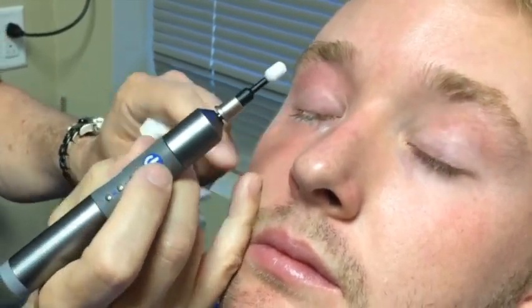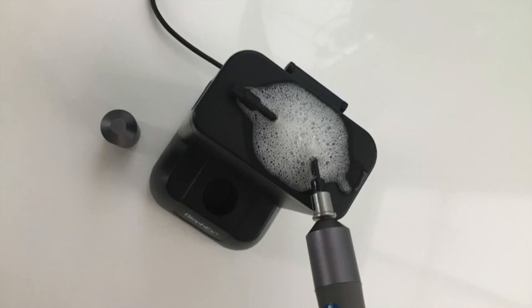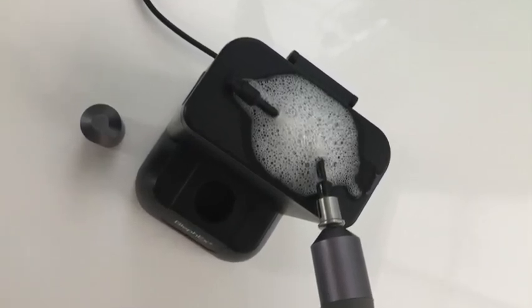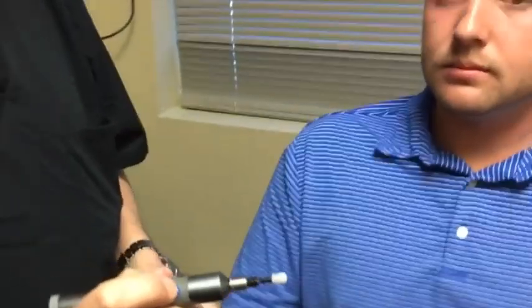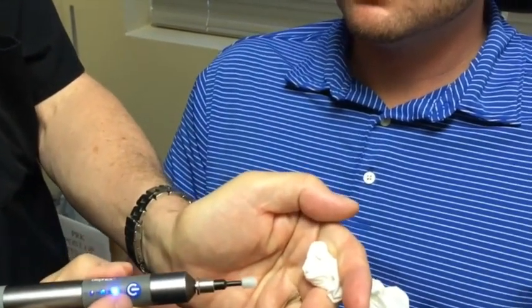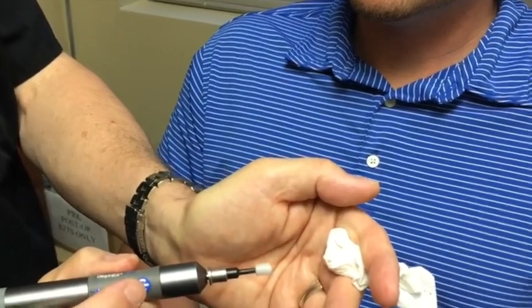And that's pretty much it. Then we hit the button again, and now it turns it off. So you give your patient a little break, they can dab their eyes, and we'll turn to the next slide. Now you turn back to the charging base, and you re-soak that tip for just about 5 or 6 seconds is all you need. Hold this down for 2 seconds. Now it's started. And when I get ready to reverse it, I'm just going to hit that same button again.